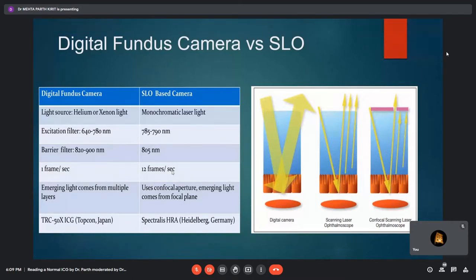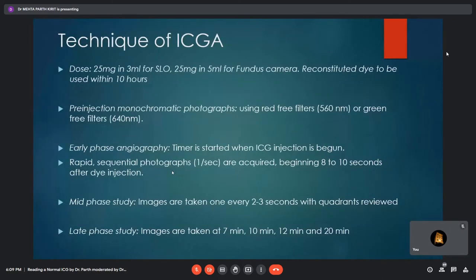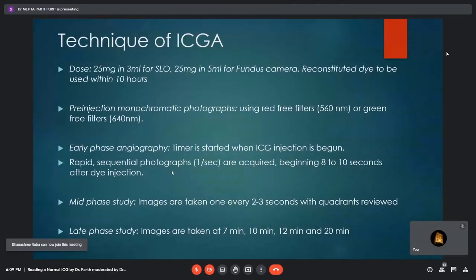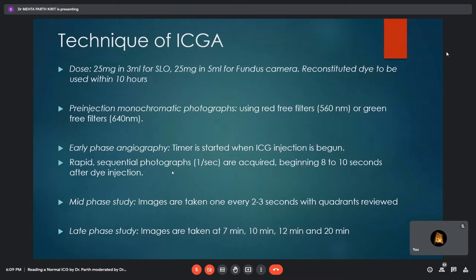The Spectralis Heidelberg used in our unit has an SLO-based camera. For the actual procedure, pupils should be dilated and the dye injected intravenously after a test dose. Before injection, red-free or green-free images are taken to detect pseudofluorescence. The dose for SLO is 25 mg in 3 ml and 25 mg in 5 ml for fundus camera. Rapid sequential photographs are taken about every 1 second after dye injection. In mid-phase, quadrants are reviewed with images taken every 2 to 3 seconds. For the late-phase study, images are taken at 7, 10, 12, and 20 minutes respectively.